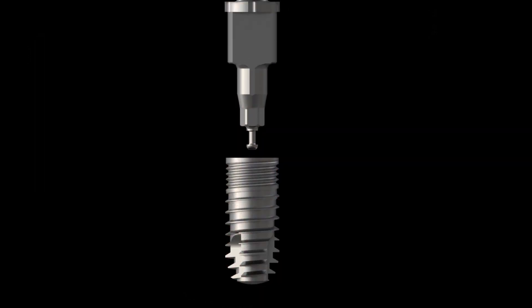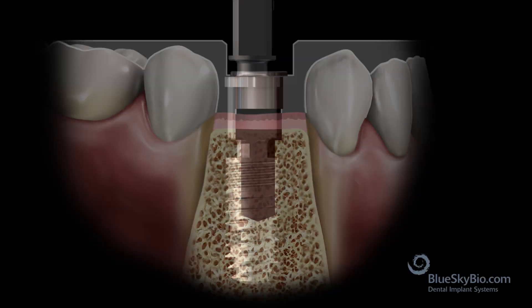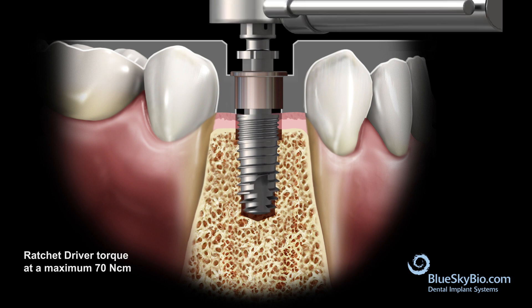Place the 8.5 millimeter fully guided ratchet driver onto the Quattro implant. Insert the implant and driver through the surgical guide. Using the ratchet, drive the implant in a clockwise direction until the stopper on the guided carrier bottoms out fully on the guide tube.